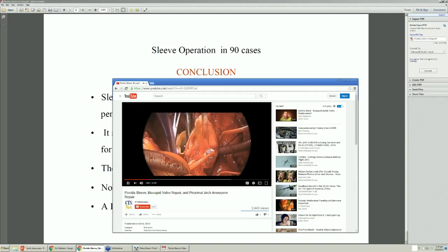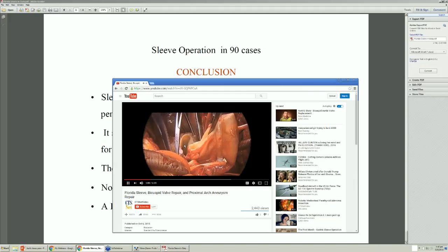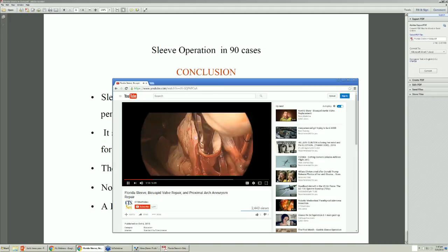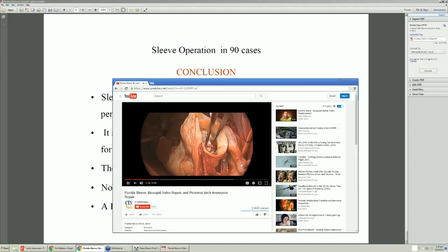Next, we're going to get a great look at this type 1 RN bicuspid aortic valve. Here you can see the conjoined leaflet. The right coronary ostium is about 12 o'clock on the screen. Because of restriction and mild aortic stenosis, we're taking off the raphe, which is called raphe shaving.